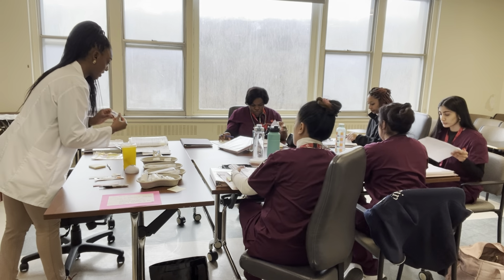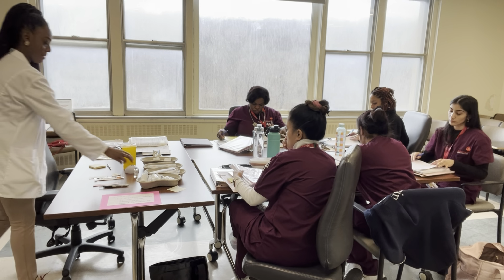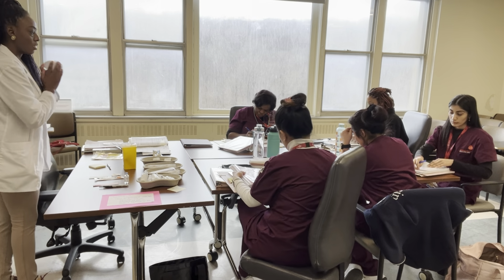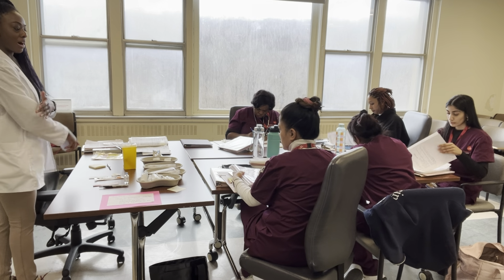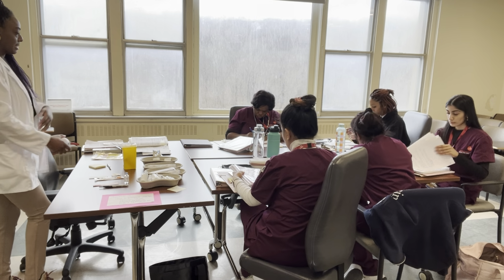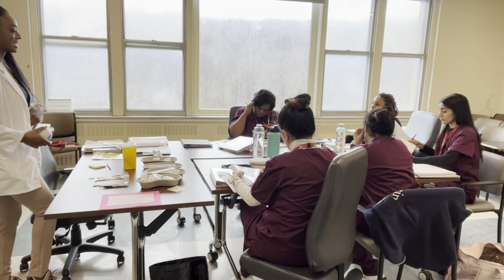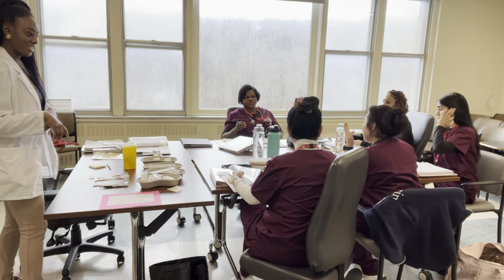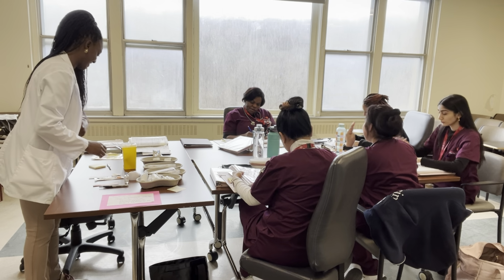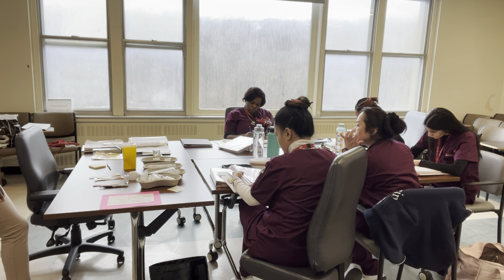So I make sure that that's what I have. Then I need to make sure that the person, obviously you're going to inject it into your patient's either their outer aspect of their arm. How far from the umbilicus do we inject? 2 inches. Thank you, Anna, 2 inches. Okay. And then, or you can do it in the outer aspects of the thigh. So now you know the regions.